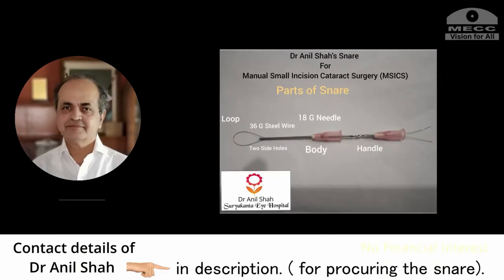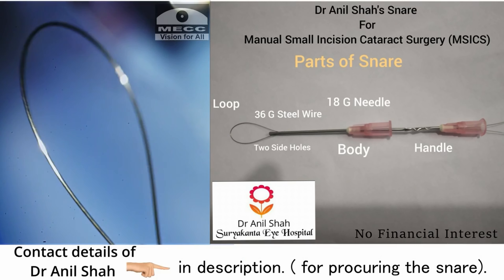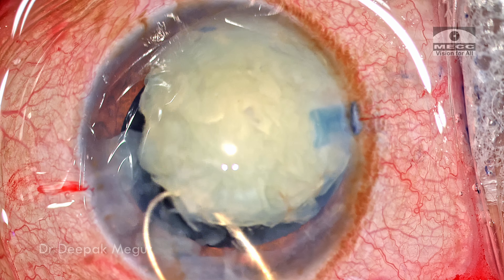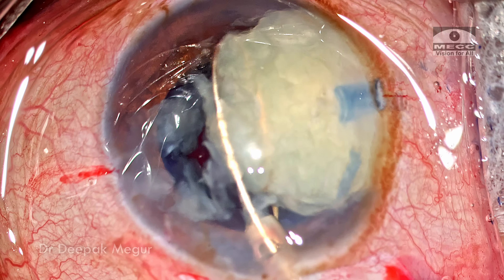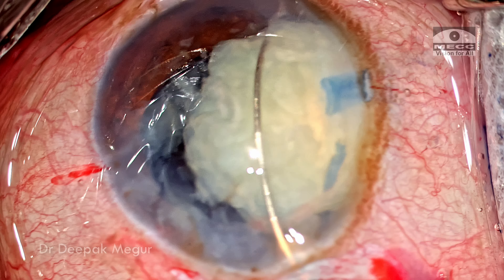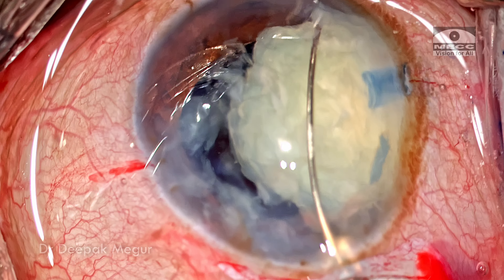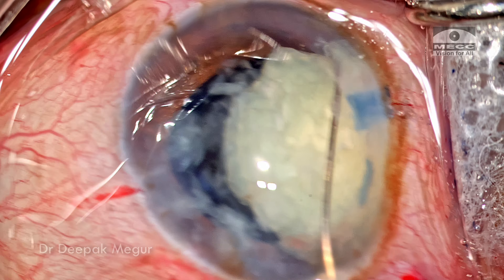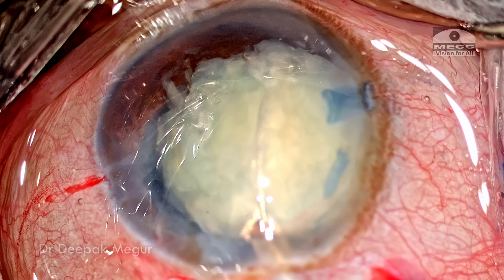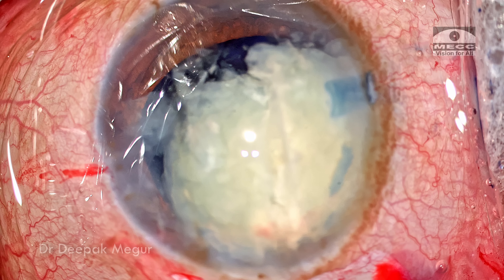Dr. Anil Shah has devised this snare and I'm going to use this device. It has a loop and is introduced into the anterior chamber in a slanted format, then goes in and hooks the nucleus. I ensure the snare is exactly at the center of the nucleus, and once I'm certain, I pull the string which closes the snare — and the nucleus snaps quickly into two halves.